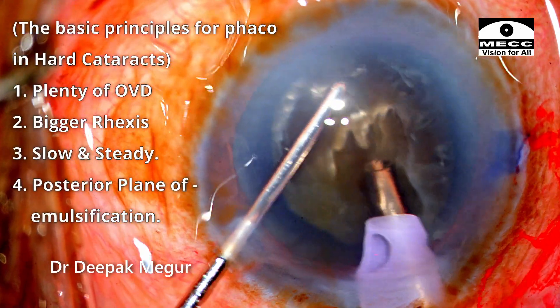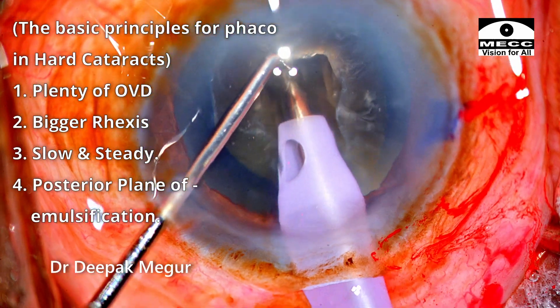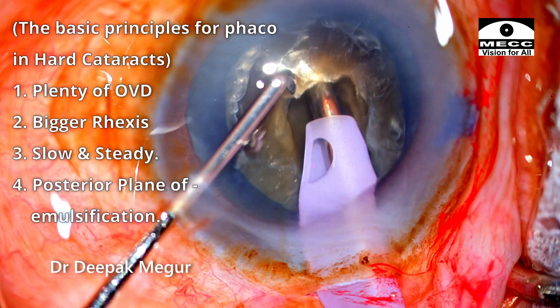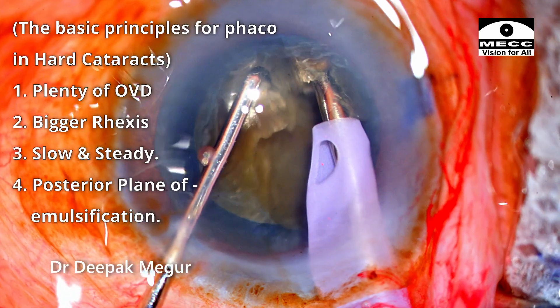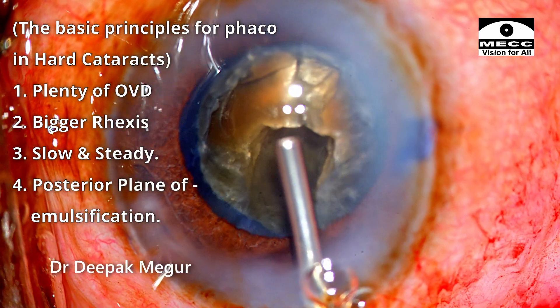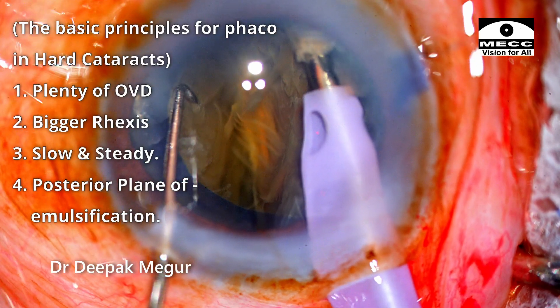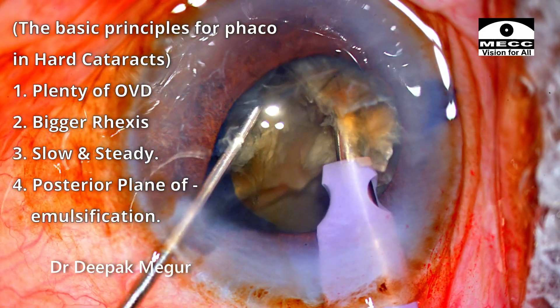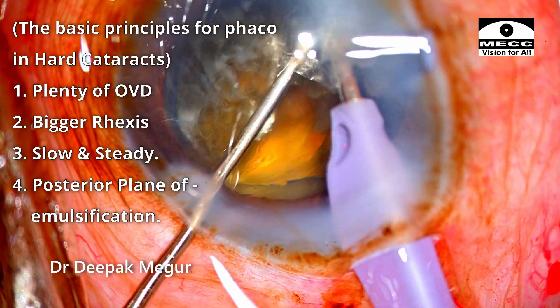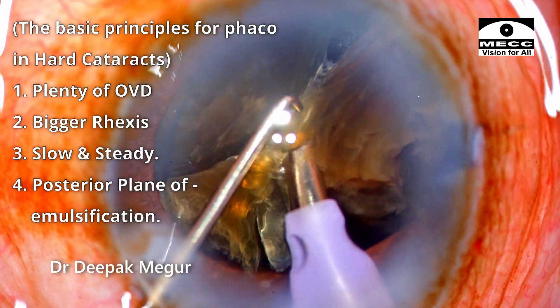But if I had a second chance, what would I have done differently? My initial trench was only 50% depth before I began chopping. If I had a second chance, I would have created a much deeper trench — approximately 90% depth — which would have significantly eased my difficulties in cracking the posterior plate. I did not go to 90% depth because I did not expect the posterior plate to be so tough, but you never know how cases can be. Nevertheless, even with a shallow trench I could complete the phacoemulsification. Although there was a lot of difficulty fracturing the posterior plate, since I was very patient and very slow, it could still be managed quite well.